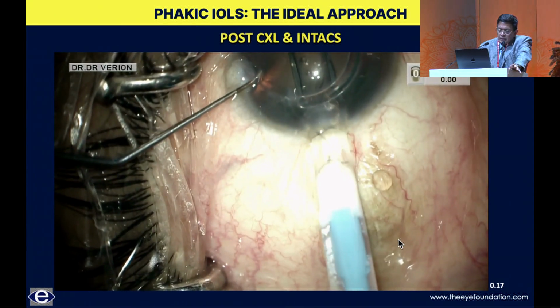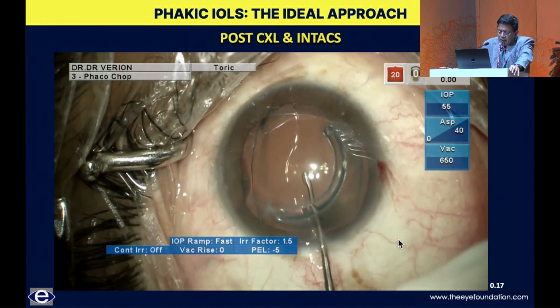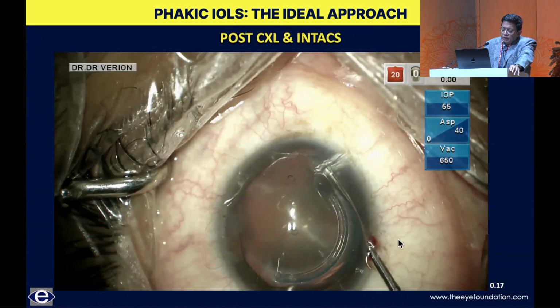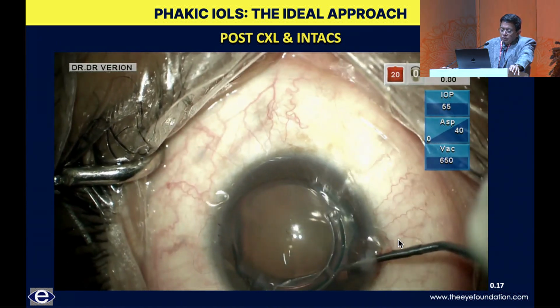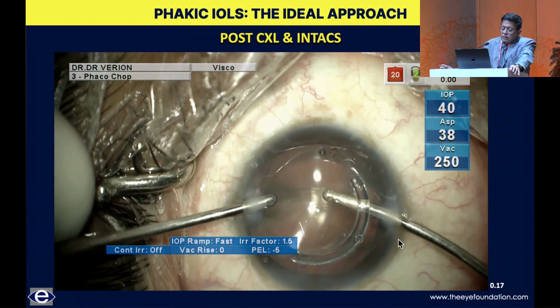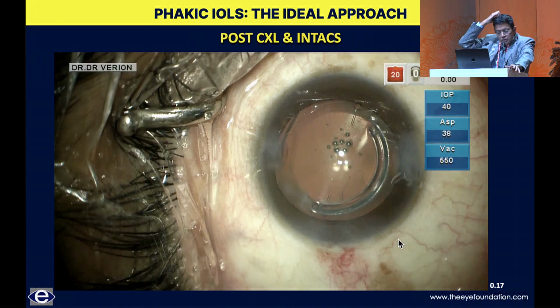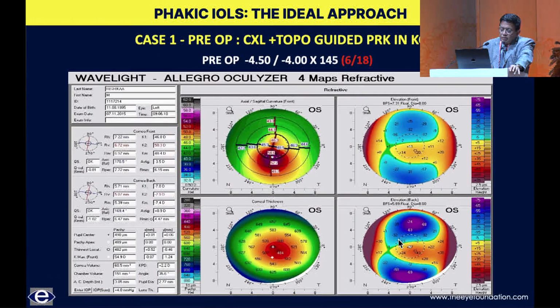That's just that case with an inferior intracorneal ring segment, where we are introducing a toric intraocular lens to take care of the residual cylinder. So essentially, this is a 3-step procedure where the first and second step are done together. Collagen cross-linking for stabilizing the cornea, the intracorneal ring segment for centering the cone, and subsequently the toric intraocular lens implantation 6 to 12 months later for visual rehabilitation of these patients.